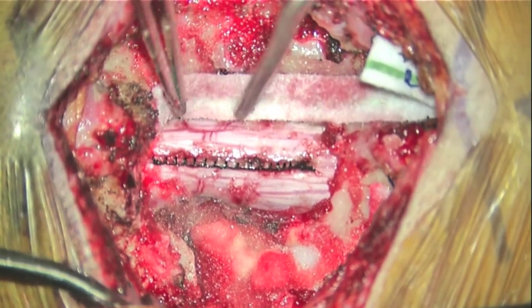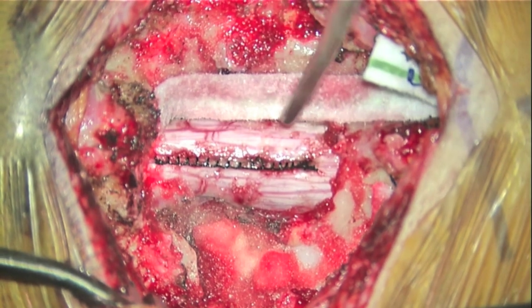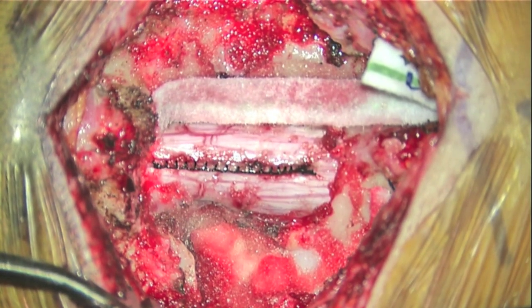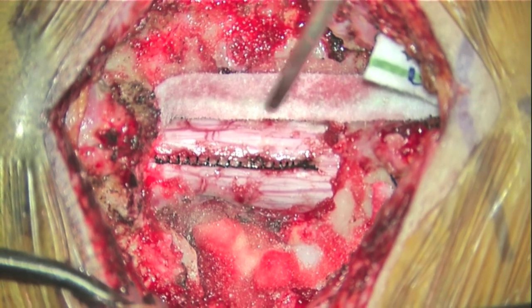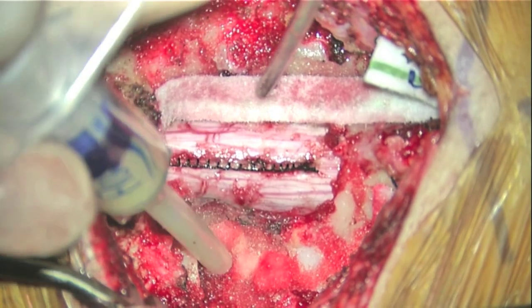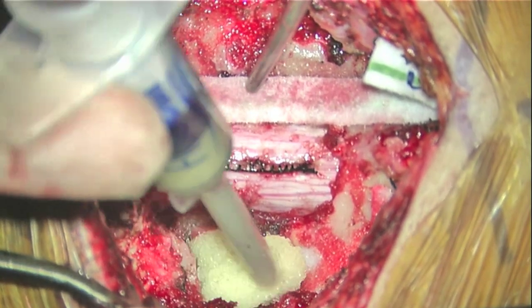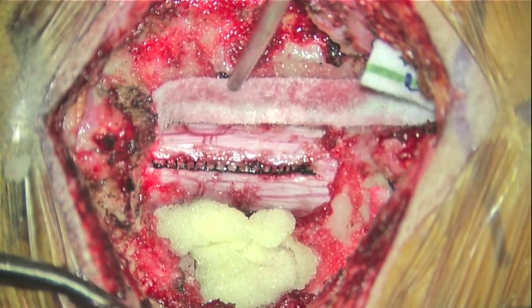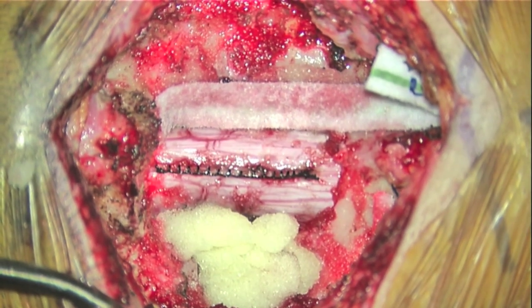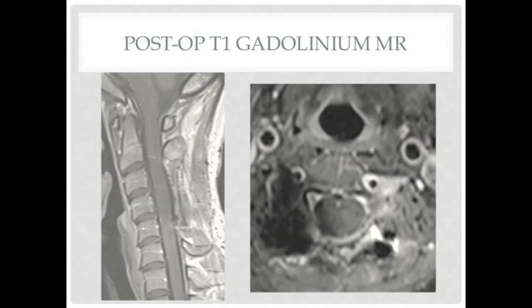In this case, because of the complete unilateral facetectomy, a lateral mass fusion was performed from C2 to C5 with pedicle screws in C2. I used a Hemovac drain and closed the muscle with a running 0 Biosyn, interrupted 0 Vicryl for the ligamentum nuchae, 2-0 Vicryl subcutaneous, and a running non-locking 3-0 nylon skin suture. Patients are kept flat until the morning of postoperative day 2, then mobilized with PT.